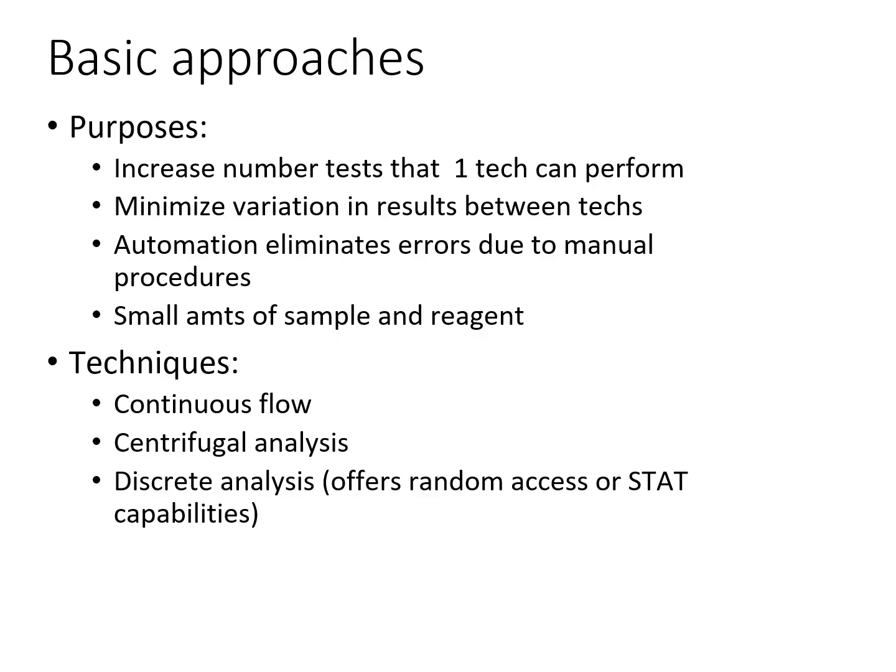So some techniques for laboratory automation is your continuous flow systems. This is where the samples and reagents are continuously pumped through a system. It's efficient for processing large numbers of samples in sequence. And early automation systems like Technicon use this method. And then we move on to the centrifugal analysis. This utilizes centrifugal force to move samples and reagents within the rotating system. It allows rapid mixing and separation during testing. Once again, this was introduced in the 1970s, and this method increased the throughput and precision.